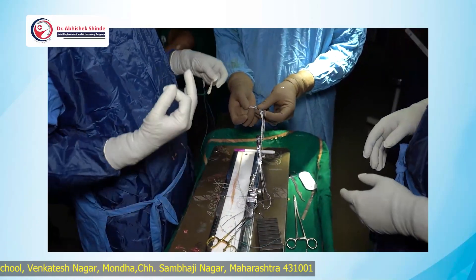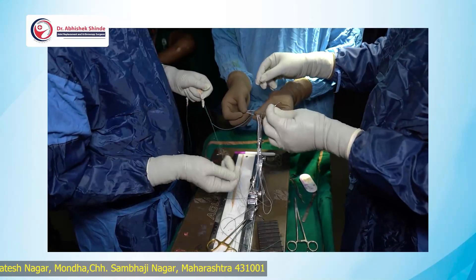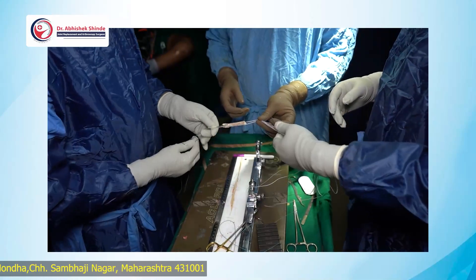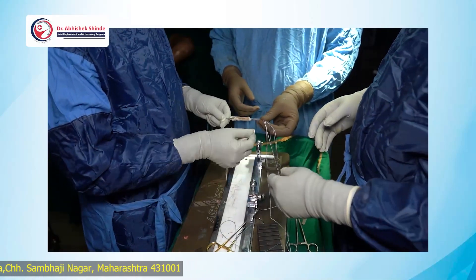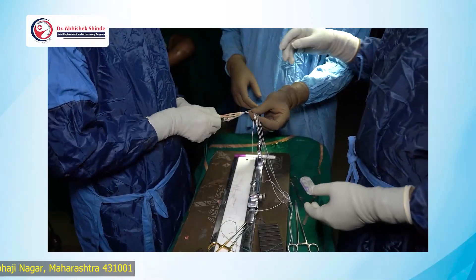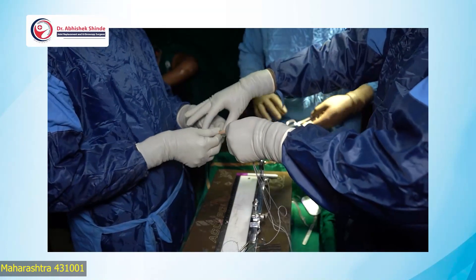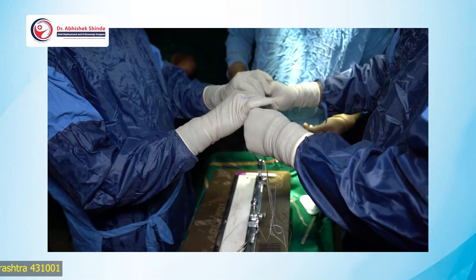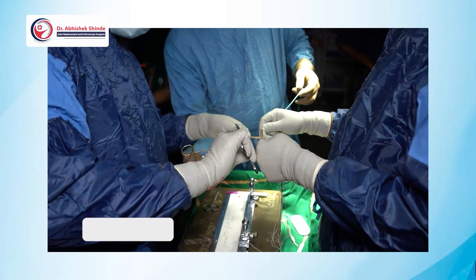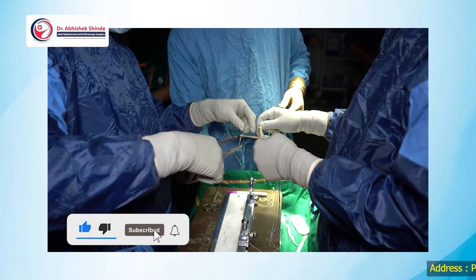Now, how much amount of the graft you want into the tibial tunnel — this is now four strand, and this gracilis is six strands separately. The gracilis is to be separately stitched with both strands using Ethibon 2.